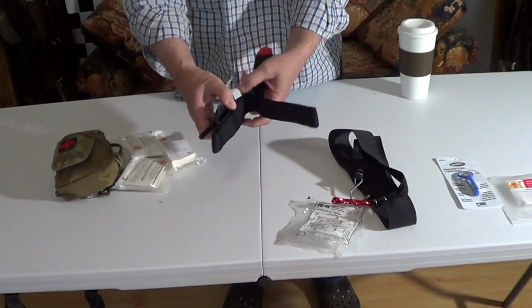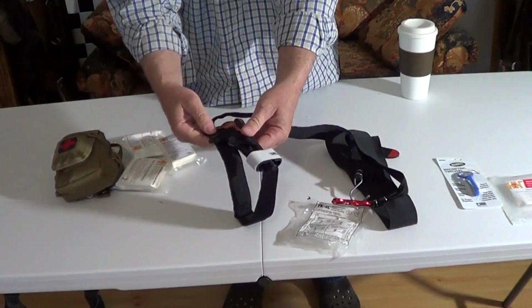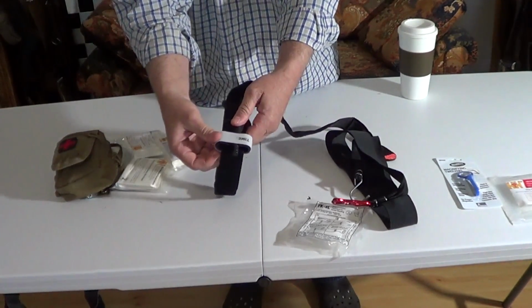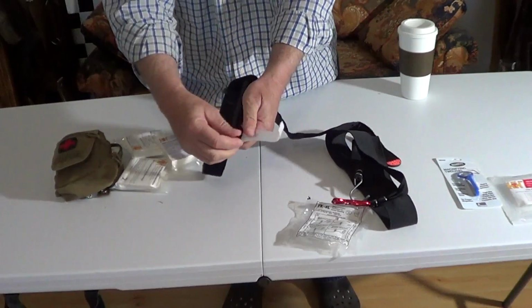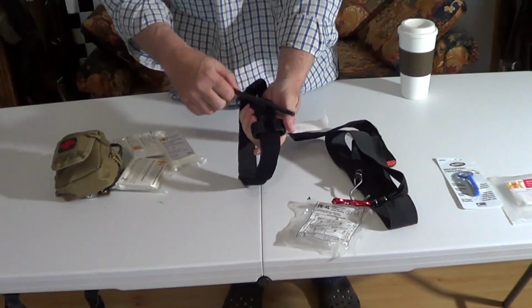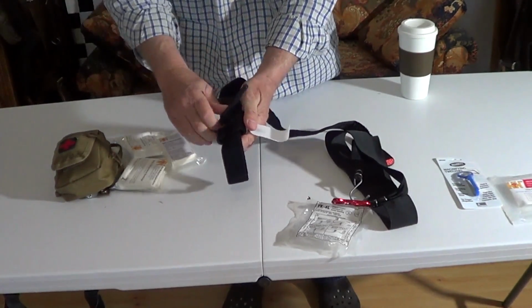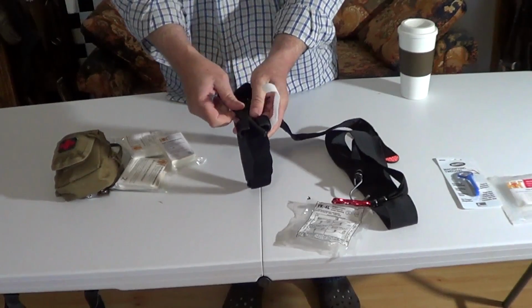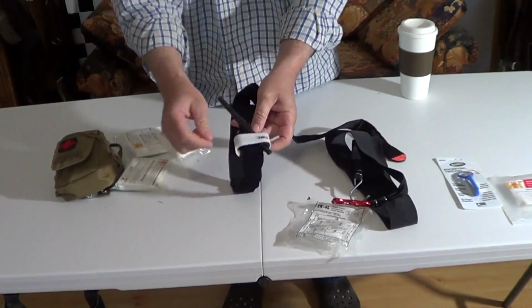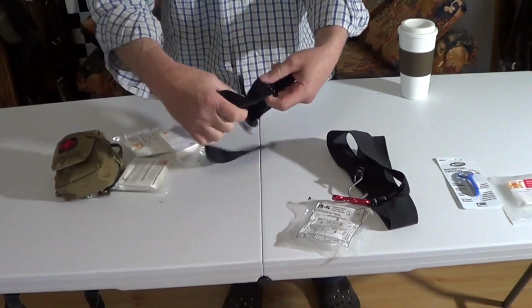This is a much better tourniquet. Goes on easy. It's got a place you can put the time. It's got a place where you can lock in your little twister. I call it a twister; I think it's called a windlass or something. Basically, once you get it on, you can twist it to make it tight, and when you twist it, it locks in here so it won't come loose. You put that across there and write the time. This is a pretty well-made tourniquet.